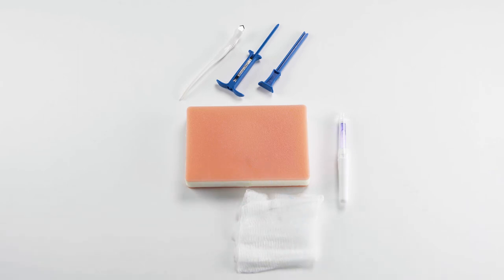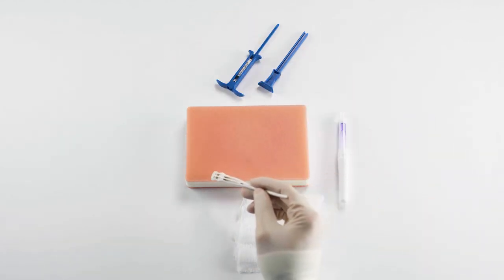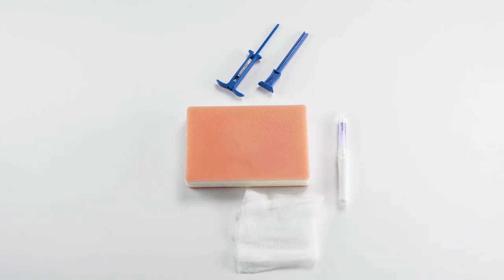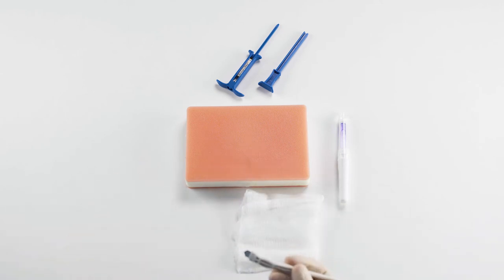We're going to allow that to absorb over the next one to two minutes. Next, I'm going to use my puncture tool and touch the patient on the right side of their chest where I haven't applied any lidocaine — they should feel a sharp sensation there. I'm going to compare that to the left side of the chest where I'm going to make my incision; they should feel a very subtle sensation, if anything at all. You can always inject a couple more cc's of lidocaine for patient comfort, but my patient says they feel fine, so we're going to proceed.